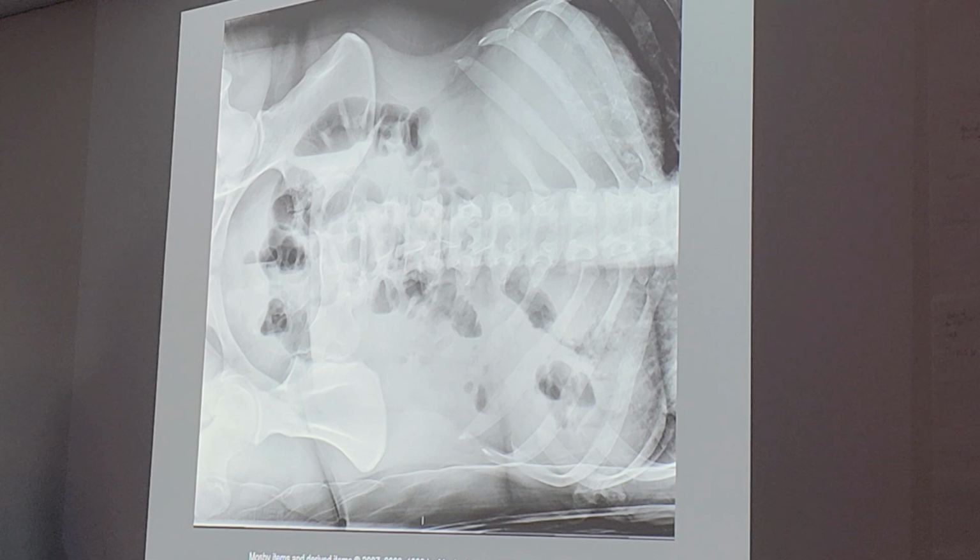We also said we only do left lateral. Yeah, left lateral is very much preferred for abdomens, the same for pneumoperitoneum, because air rises away from the gastric area, right?